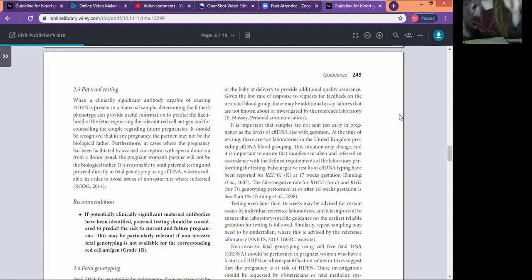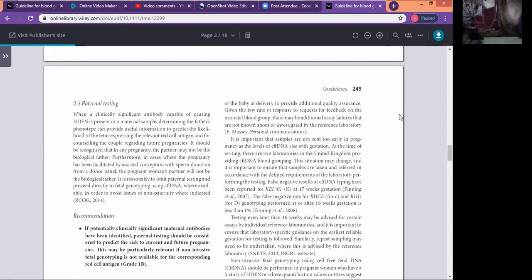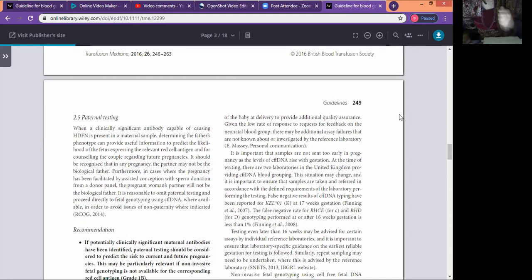We also need to run an internal control. An in-house control would be an anti-D standard run in parallel with this. Any increase of more than one dilution in a subsequent test, for example a rise from a 2 to an 8, would be considered a significant rise.